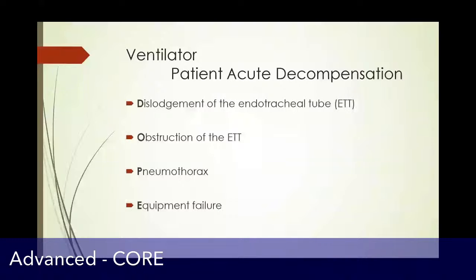P, listen to see if they have a pneumothorax. Or E, is there some sort of equipment failure? Is there a leak in the tubing? Is the ventilator turned off somehow? Look at everything. Look at your surroundings. Look at everything they're hooked up to, and troubleshoot that.